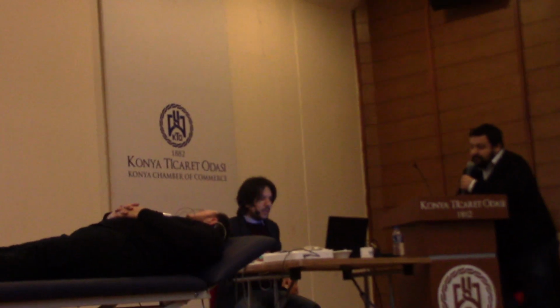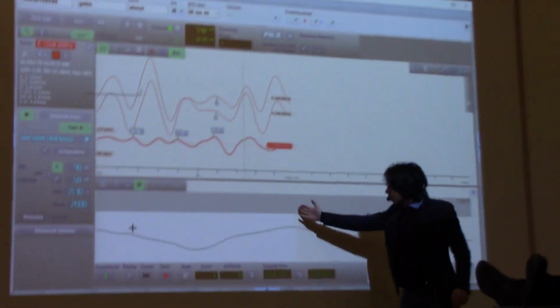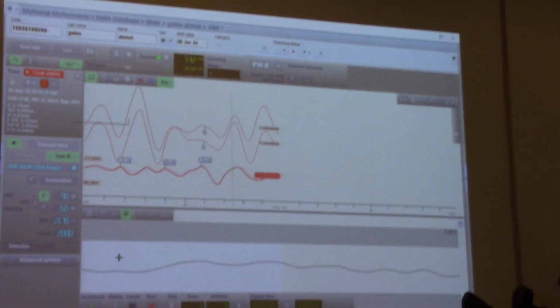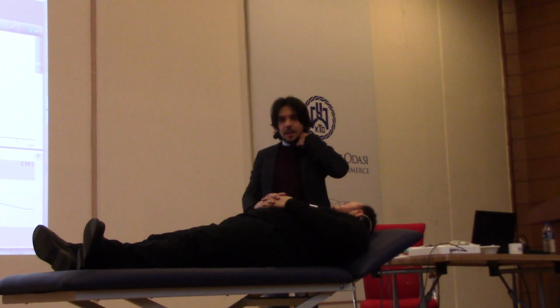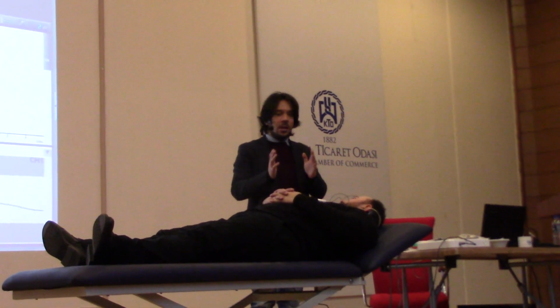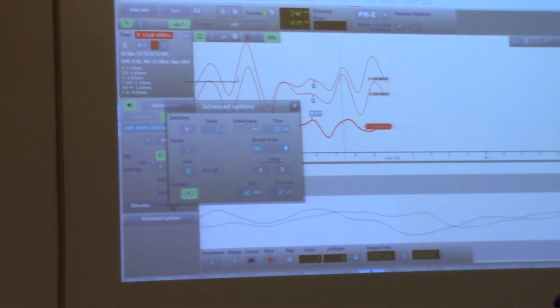And now consider that there's an area here that is white and stops here and darker on the side. The two areas are a difference in our system. The earlier area is the pre-stimulus area. It means that before the stimulus comes, it will get a response 10 milliseconds pre-stimulus, 10 milliseconds before.